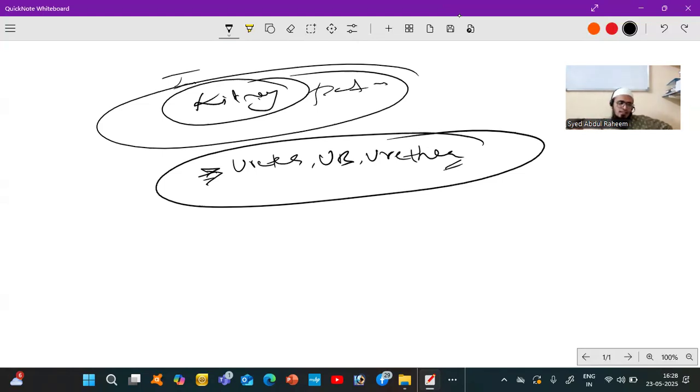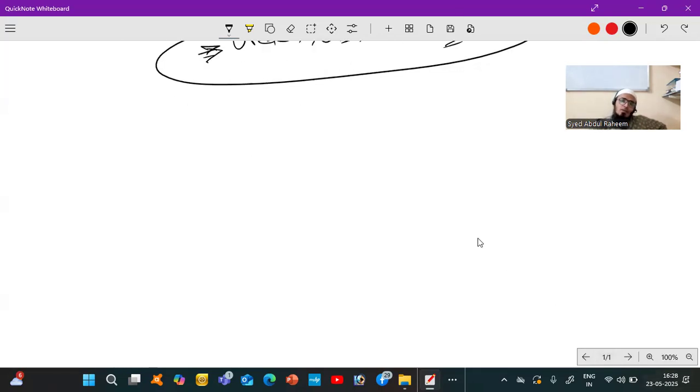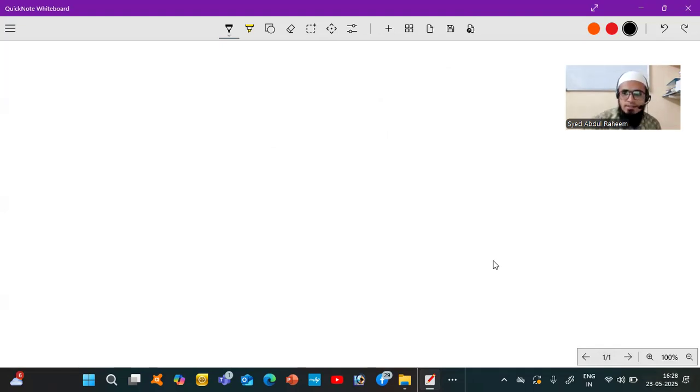Okay, so let's discuss ureter, urinary bladder, and urethra. They have more numerous diseases. It's difficult to cover all of those, but I will mention four important diseases which we will see in our clinics mostly. One is urinary bladder calculi. The calculi may be in the urinary bladder or in the ureter.